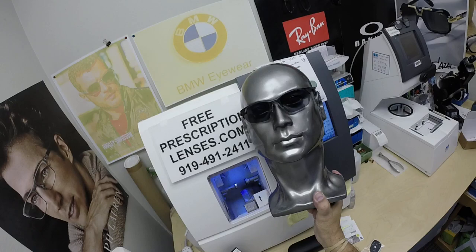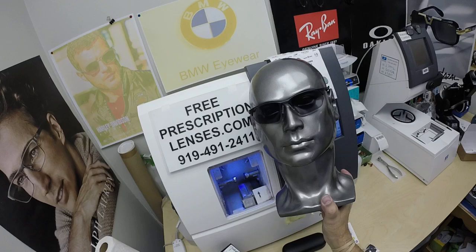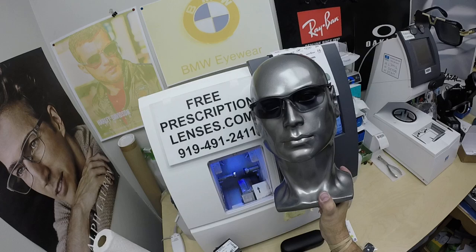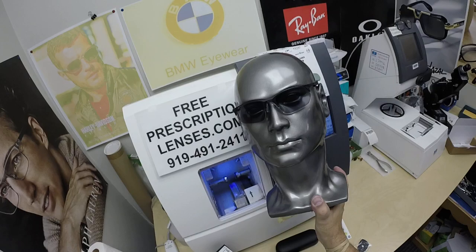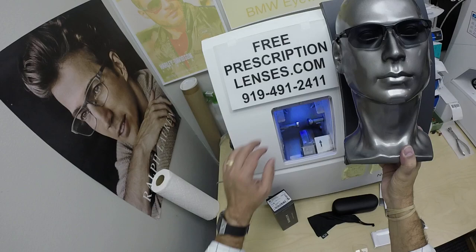The other nice thing about the Zeiss Photofusion lenses: they were the original blue blocking lenses, so they will block over 50% of blue light from today's electronic devices — cell phones, tablets, computer screens, and more. They do all that indoors, and over 95% blue light blocked outside. The majority of blue light actually comes from the sun, so you can have over 95% protection while outdoors.